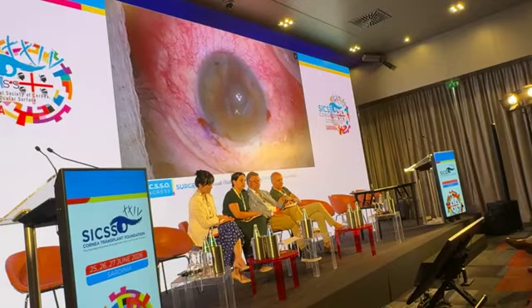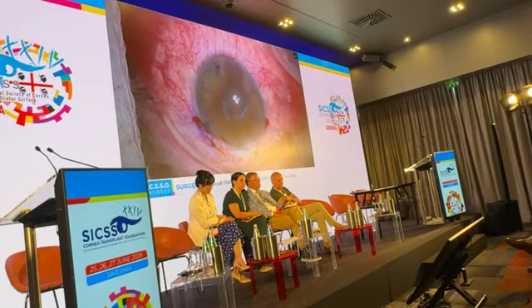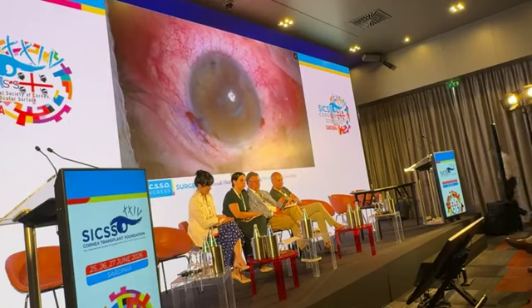Now is it perfectly focused? And perfectly centered also? So this is the last stage and the final stage. You just wet the cornea.